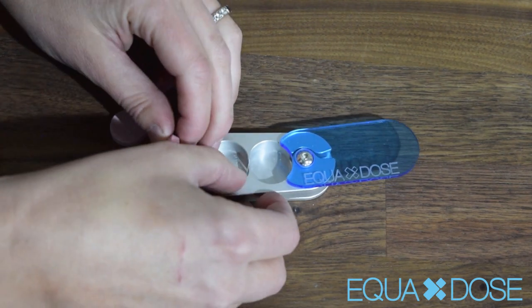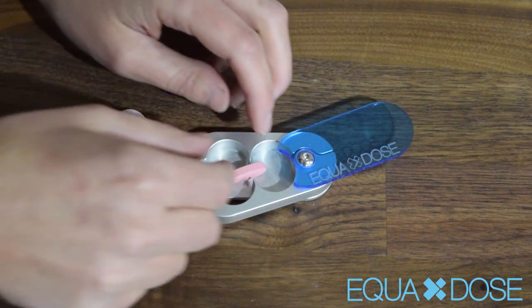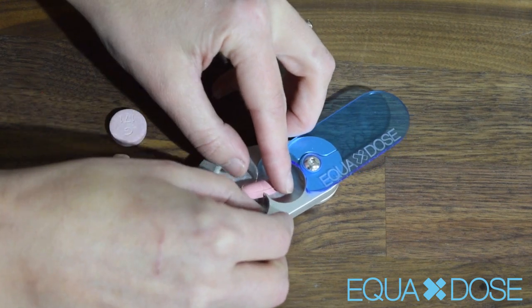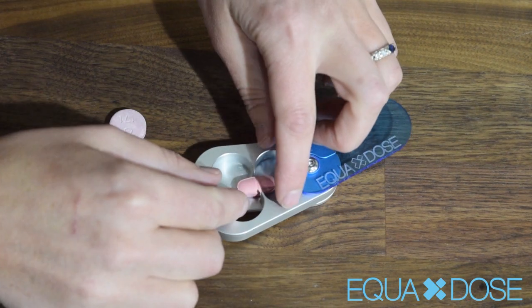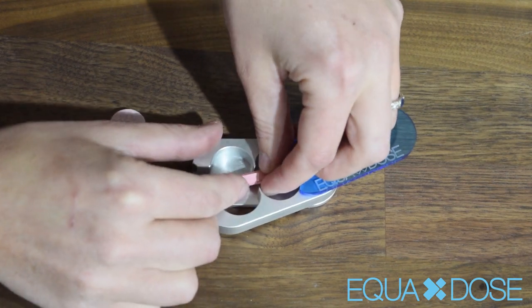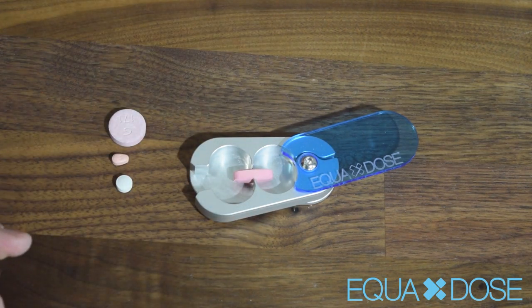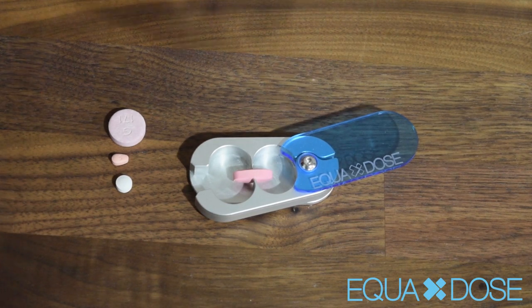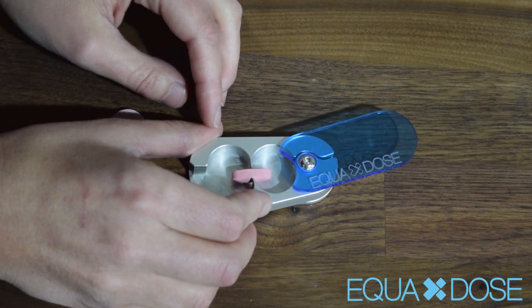The first most important thing to remember is that this goes up on its side when you cut it. With a single blade pill cutter, you're going to lay it flat, but with our pill cutter, you're going to want to put it up on its side. Now, if it has a score mark, line it up on the score mark, but if your pill doesn't have a score mark, that's okay — that's what this pill cutter is designed to do. It scores the pill, and so the main thing is just that you line it up by eye.